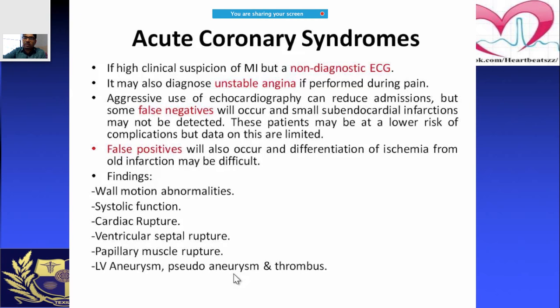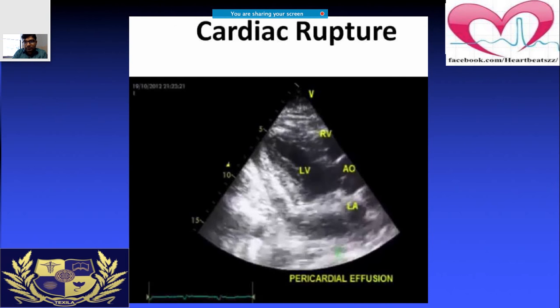Echo findings in ACS include wall motion abnormality, deranged systolic function, cardiac rupture, papillary muscle rupture, ventricular septal rupture, and aneurysms. In this echo image, there is not only a pericardial effusion but also a rupture visible.